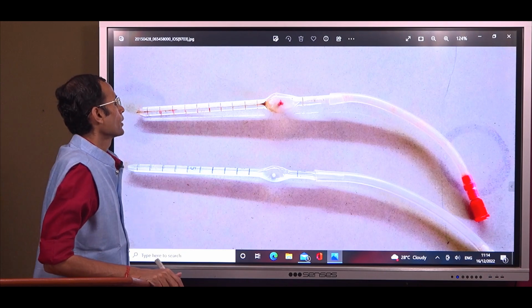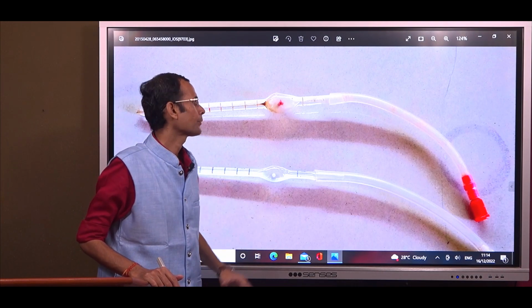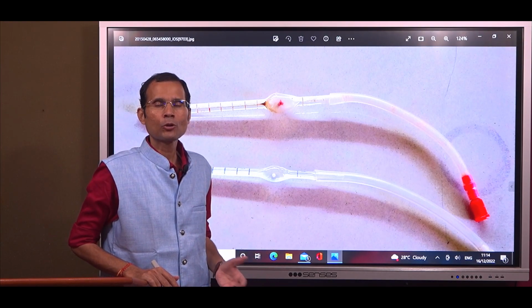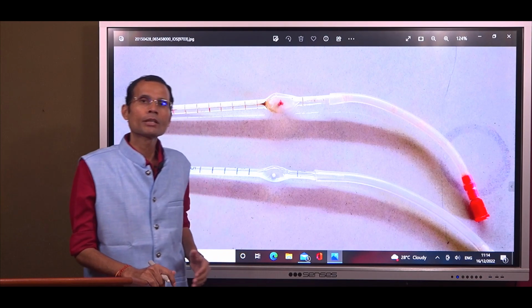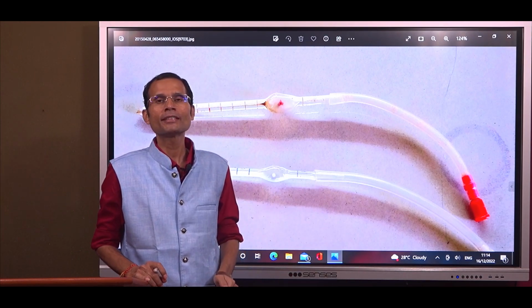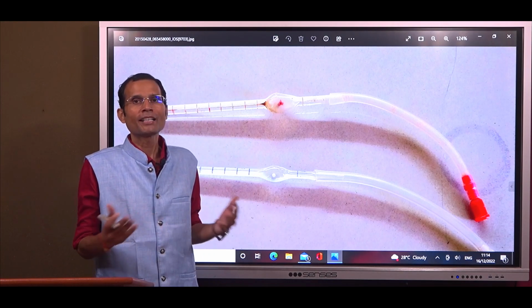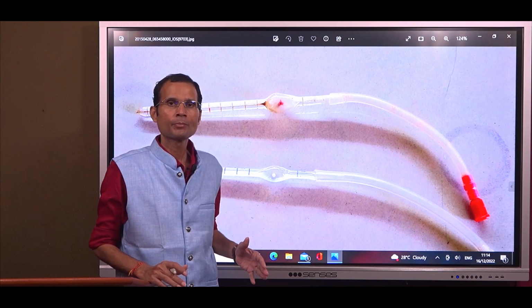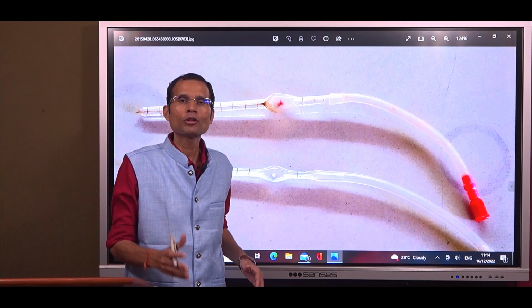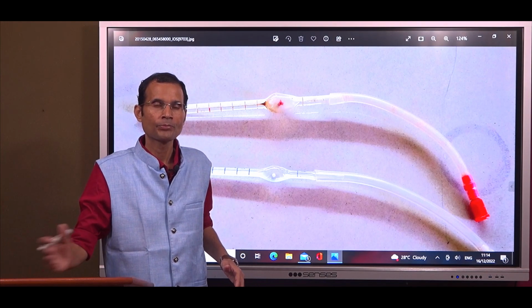All right. So that's about the diluting pipette and how much dilution. Sometimes the teachers also ask this question: can you use the RBC pipette for WBC count? Remember, by now you must have understood the concept. WBC count is in thousands, therefore we dilute the blood only up to 20 times.